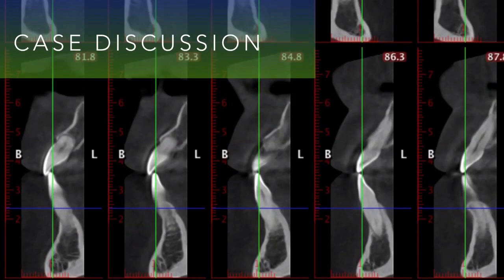Now, I doubt very seriously that the DIY aligner company caused that damage to the tooth. I don't think they helped it much because they essentially threw it into traumatic occlusion, which is why I think there's a widened PDL space. But they certainly didn't help the situation. And if you look there where the red arrows are, you can see in these slices how little bone there is on the facial surface of those teeth.